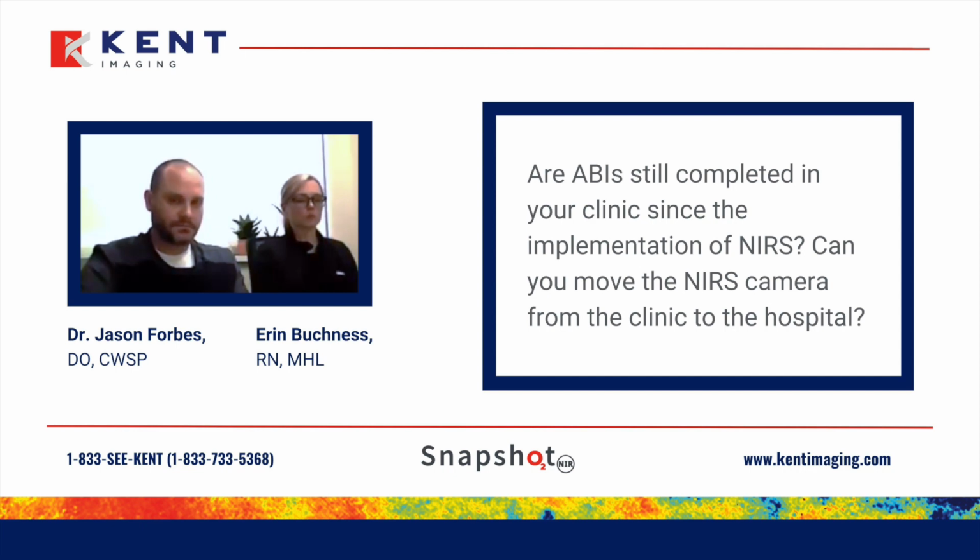And there's actually a question that came in. Do you continue to complete ABIs in the clinic since starting this technology in the office? But you just made the point that the technology is portable and you bring it to the clinic and the hospital, yes? Yep. The camera's small, probably about that big, couple pounds. We house it in one of the cabinets locked up at night, take it out in the morning. It can go from room to room, easily cleanable, not an issue. And you can go in and out of rooms with no issue.